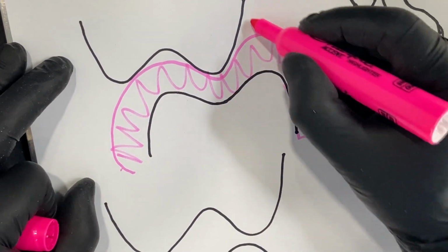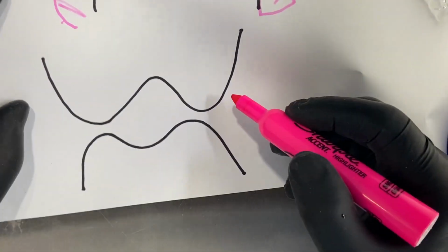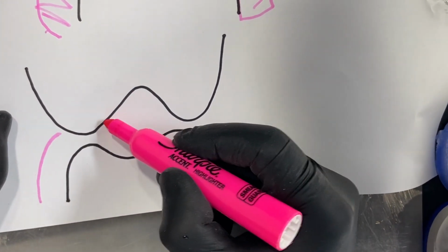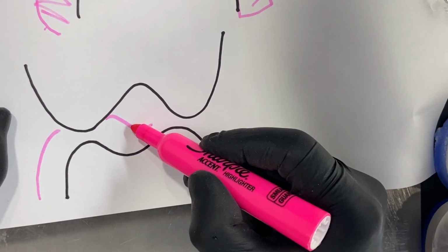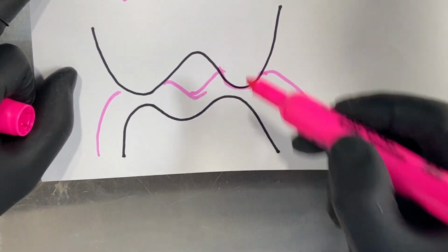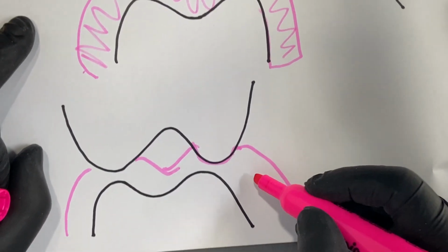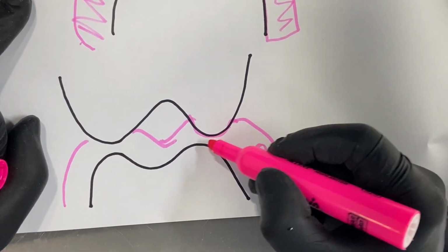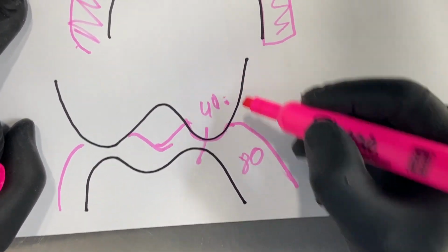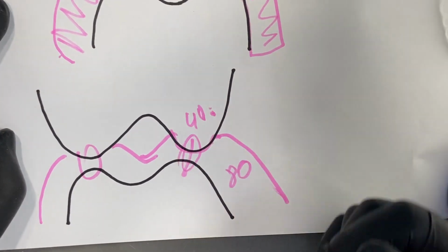But if the bite that you take creates a cross bite, for instance, we're going to have areas where we cannot have those 2 millimeters. Those points will eventually be fracture points. Why? Because if in 2 millimeters we have 80 megapascals, in areas where we have less, we're going to have half of the strength. So these areas of cross bite are going to be really fragile, with a tendency to break.